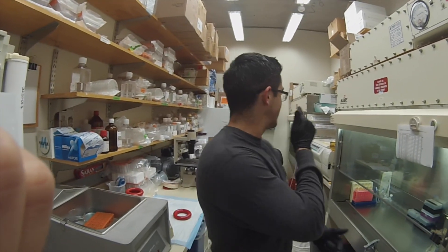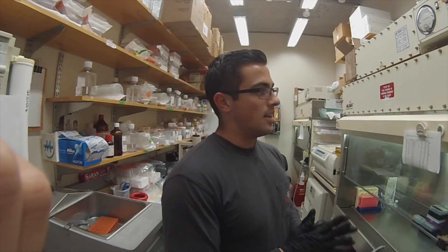Today I'm going to be splitting and starving my cells. This is important just so you have a good baseline for where your cells start at.